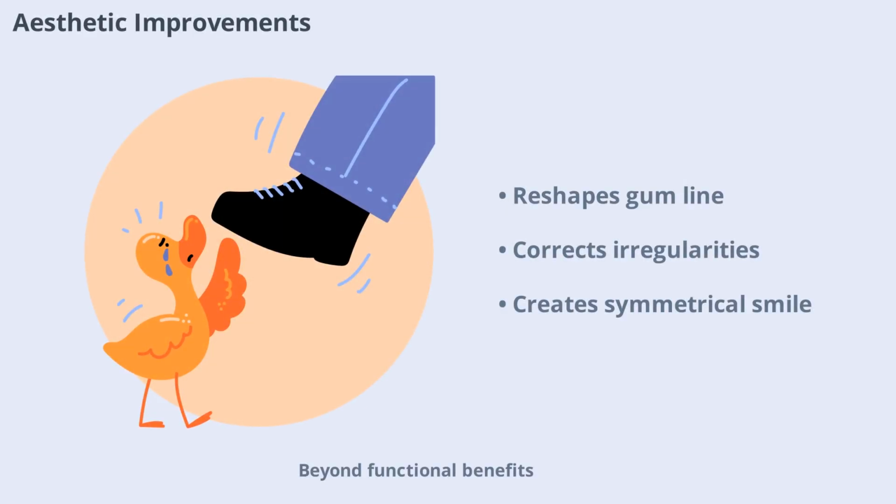Beyond functional benefits, gingivectomy can enhance the appearance of the gums and teeth. By reshaping the gum line and correcting irregularities, the procedure creates a more balanced and symmetrical smile. This is particularly valuable for patients concerned about the aesthetics of their teeth and gums.